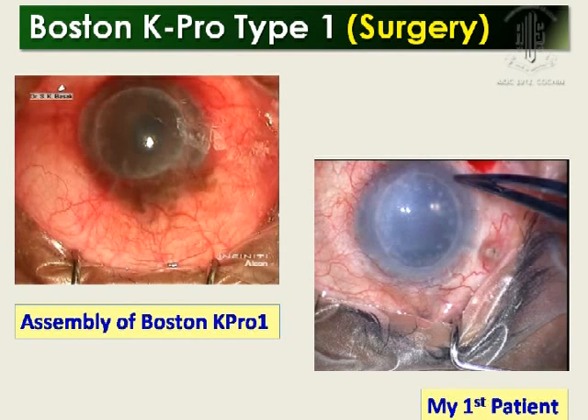I am now showing the assembly part. You need to measure the thrice-failed graft, then make a 9 or 9.5 mm trephination. I use the 8-point back plate in this. I make a center point on the front part of the cornea — this centering part is very important. Sometimes it may decenter a little, and decentering is not good because passing the suture is difficult. You make a central hole of 3 mm. The whole assembly comes in a box with stickers and adhesive. This adhesive sometimes causes problems — it can stick with the optic for a long period of time and patients do not get good vision because of irregular astigmatism.